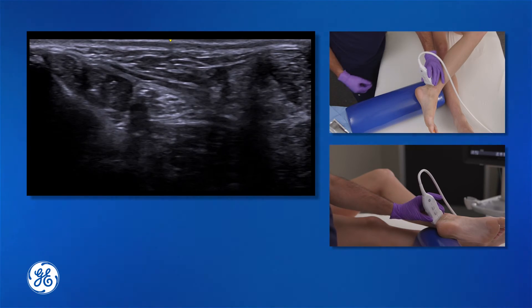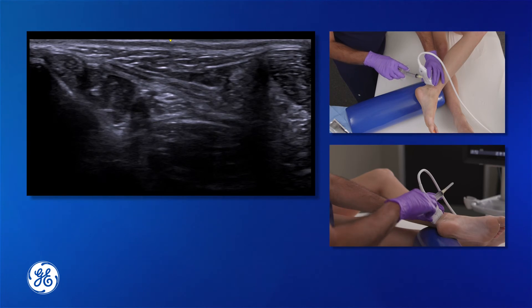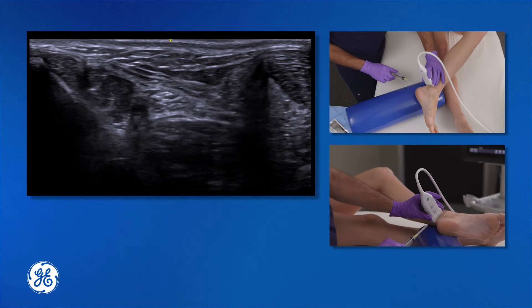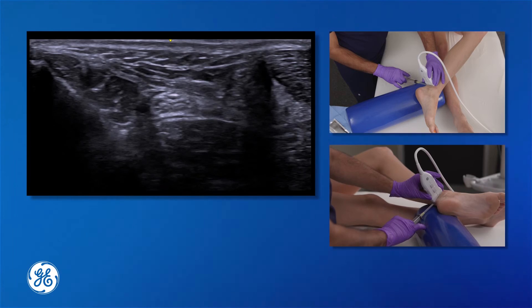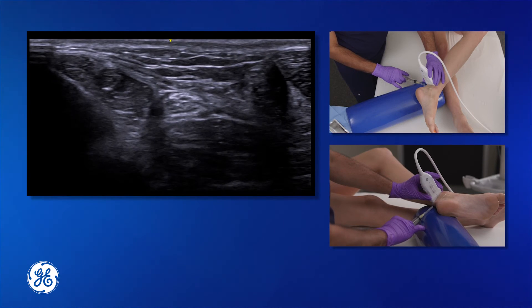Using a needle attached to a syringe with local anesthetic — I like a 27 gauge needle attached to a control syringe — insert the needle adjacent to the transducer, taking care to miss the Achilles tendon in the longitudinal fashion.